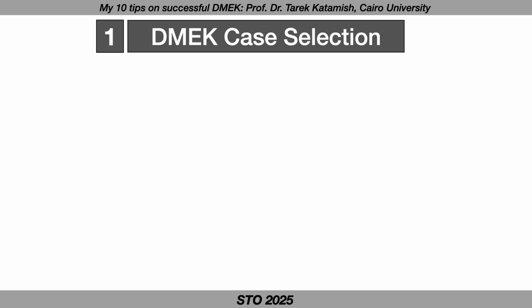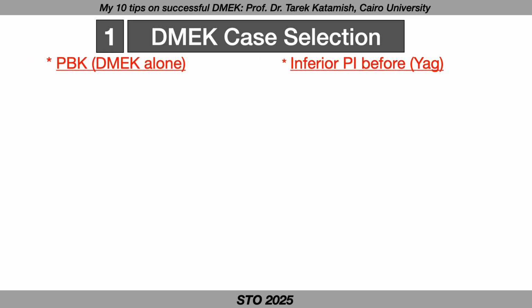So in your early cases in your learning curve, try to do pseudophakic bullous keratopathy, DMEK alone, not combined with cataract. And if you can, do inferior iridectomy before the operation by YAG laser. It will be much easier for you.